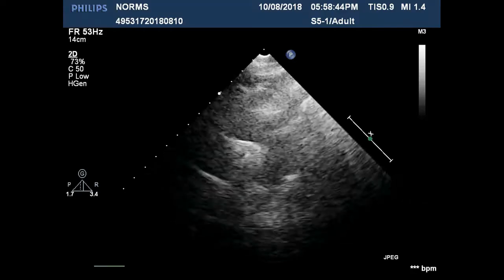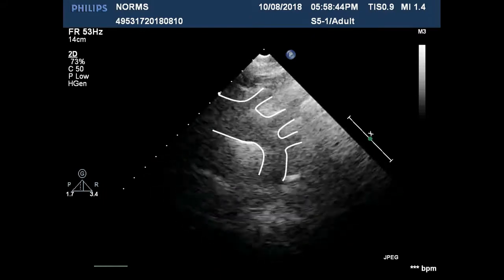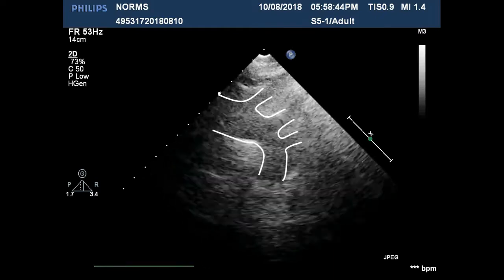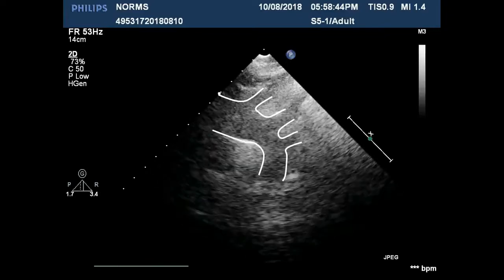This is the aortic root, the arch, and the ostia of the innominate, subclavian, and common carotid arteries, and below is the descending thoracic aorta. You should check all these views for features of aortic dissection.